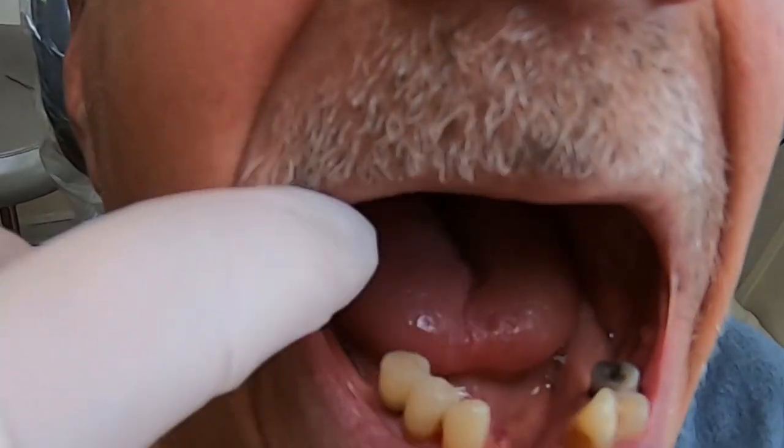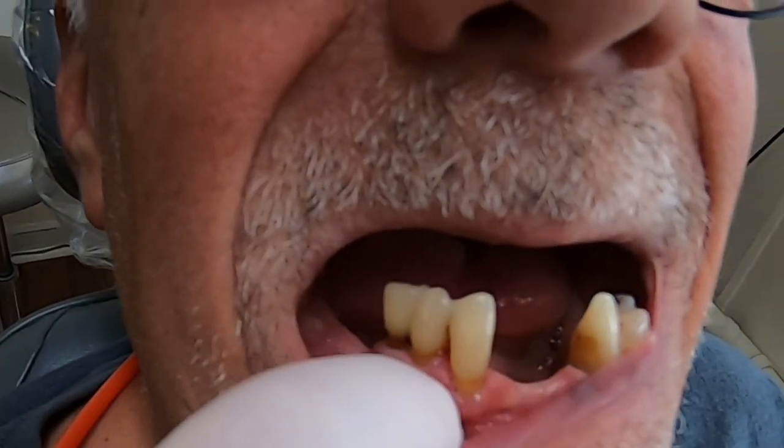So on the bottom, he's got six teeth left, three on each side. He's got some bone loss, as you can see.